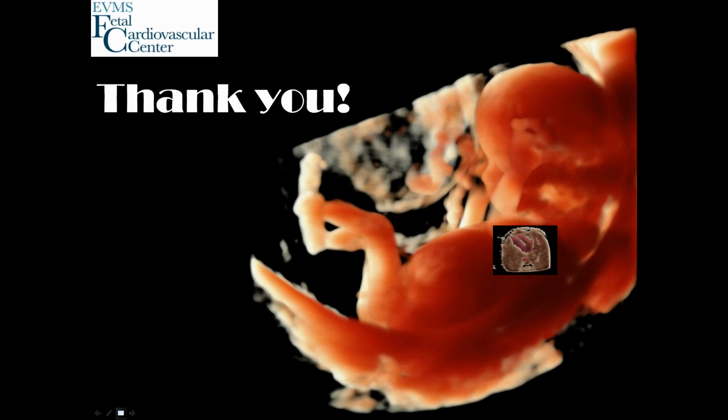At what gestational age do you recommend performing the early fetal echo without the need to use transvaginal ultrasound? Realistically, 15 weeks gestation is probably the time when you won't be able to benefit from the transvaginal scan, because the fetus is usually bigger, especially if the baby is in a breech presentation. So you can try, but it's not going to be successful or helpful anyway.